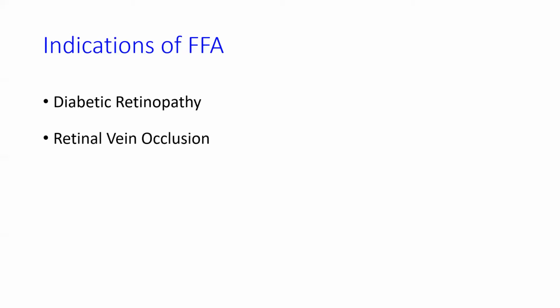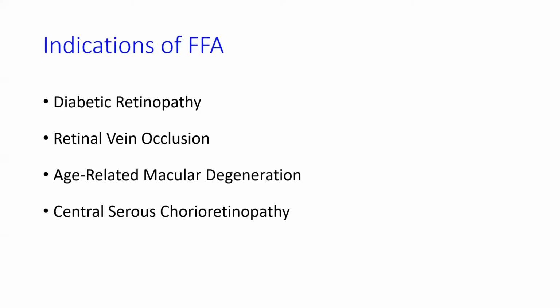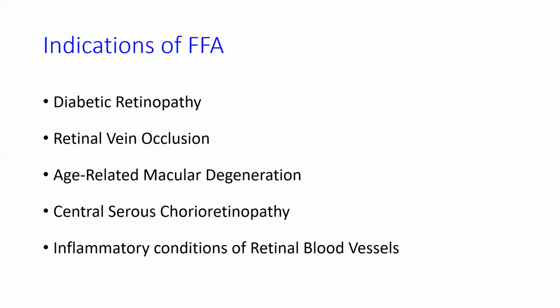Fluorescein angiography is commonly indicated in patients of diabetic retinopathy, retinal vein occlusion, age-related macular degeneration, central serous chorioretinopathy, and in inflammatory conditions of retinal blood vessels.